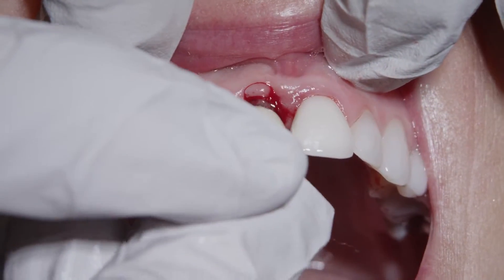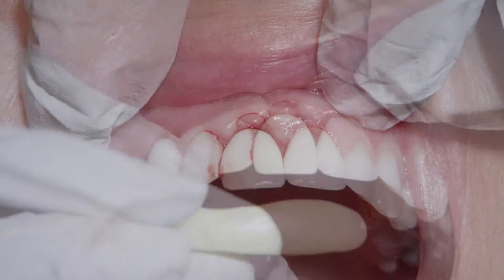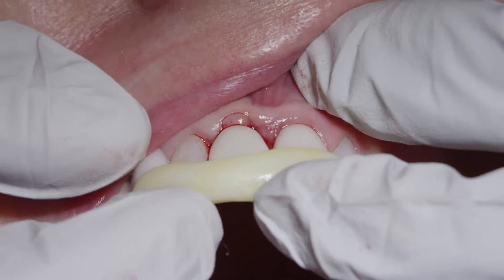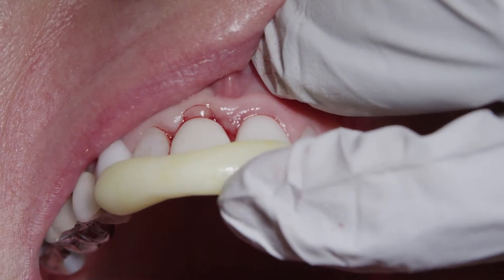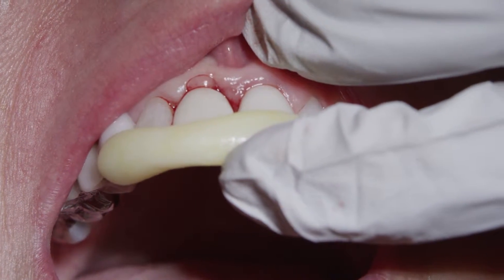If you're inserting a single crown restoration, the lab technicians, after making the crown, can make a small jig that we can extend passing over the crown to the adjacent teeth, so we know exactly the position the crown should be inserted, because this is the way the technicians made the crown.